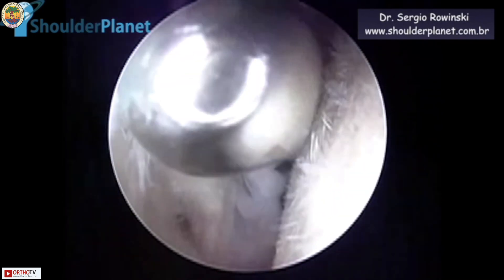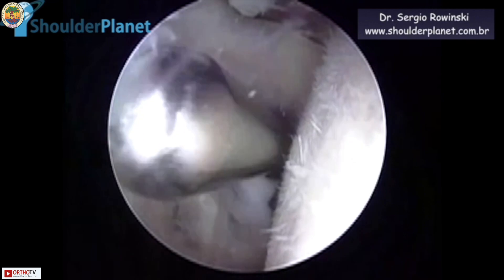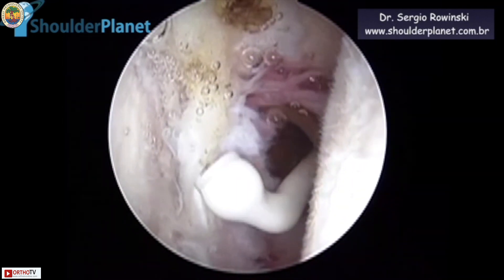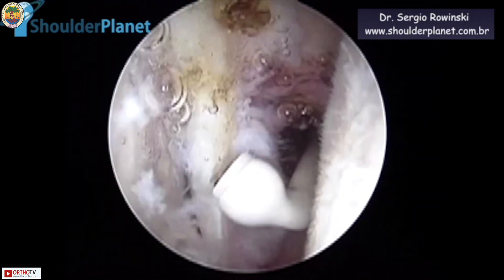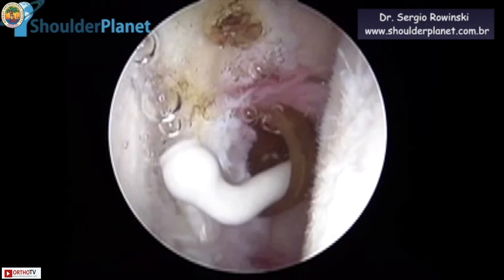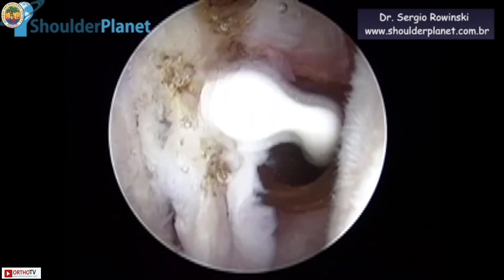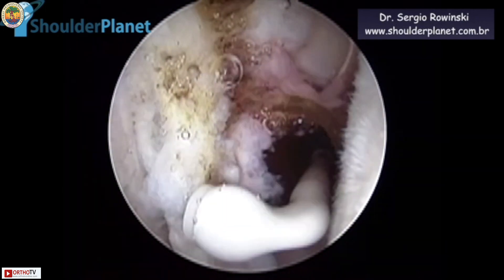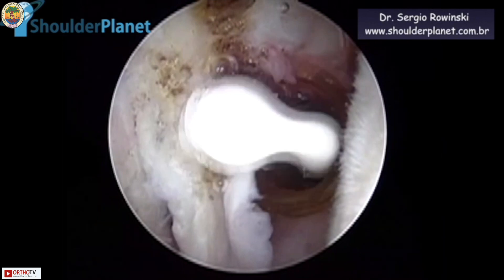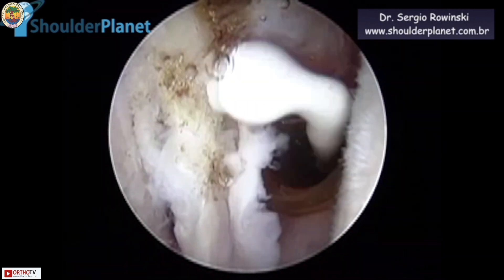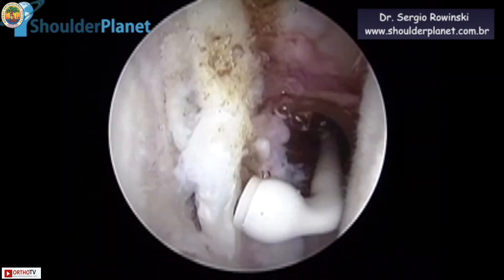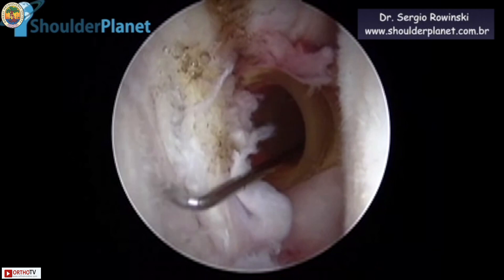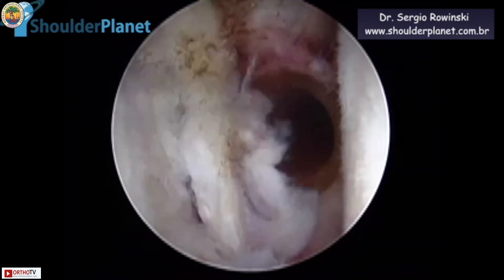An interesting arthroscopic finding was that the patient had a Buford complex in his right shoulder — a cord-like middle glenohumeral ligament. We are just cleaning it now. It had nothing to do with his pathology, but we needed to address it. The ligament was really very nice.